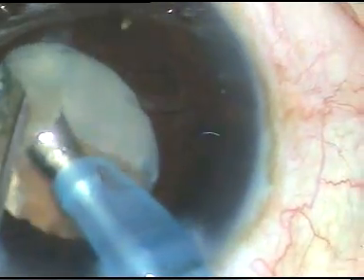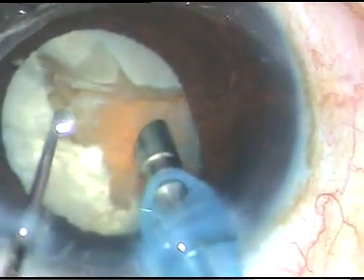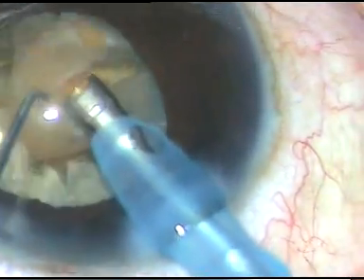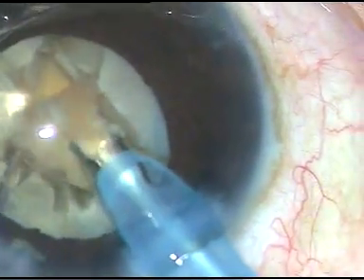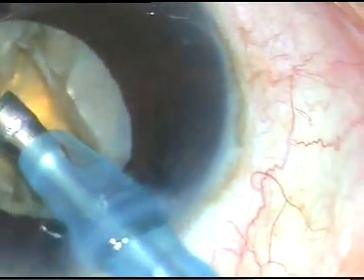This endonucleus has to be emulsified separately. So what I do is, I turn the tip towards the endonucleus, hold it, separate it from the rest of the mass, and apply ultrasonic energy on it and remove it.